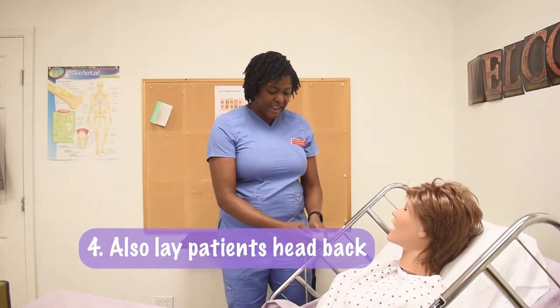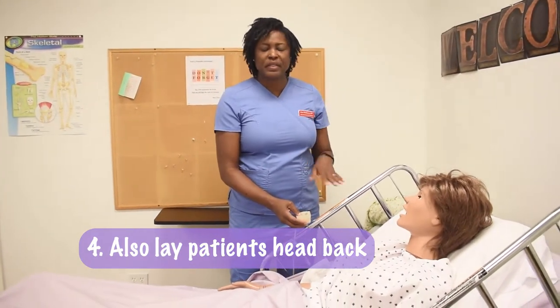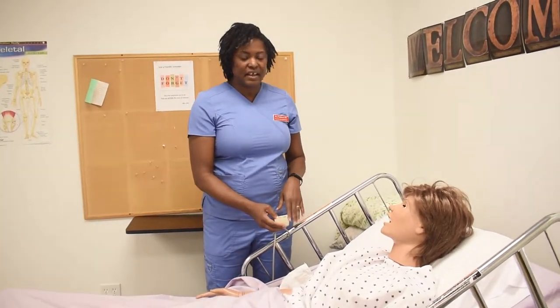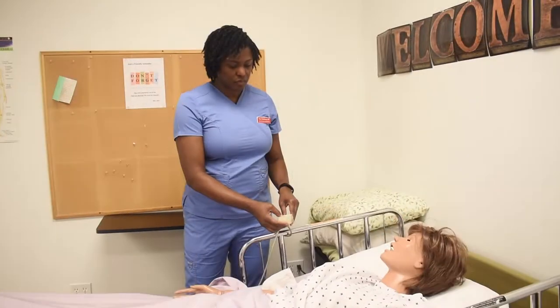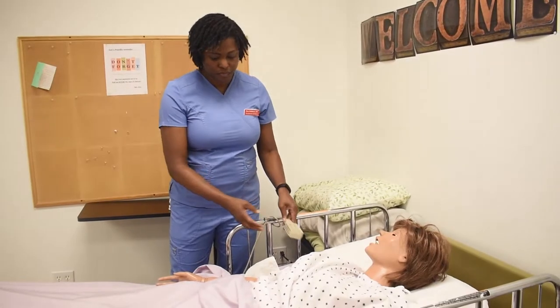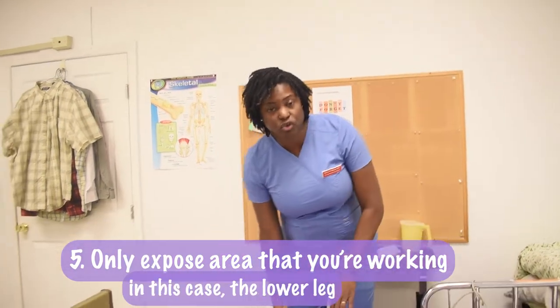I'm also letting her head down. It's just easier to work with the resident when they're lying flat in the bed if they can go back that far. Whatever we do with the client, we only want to expose the area that we're working with. I'm only going to expose her lower leg.